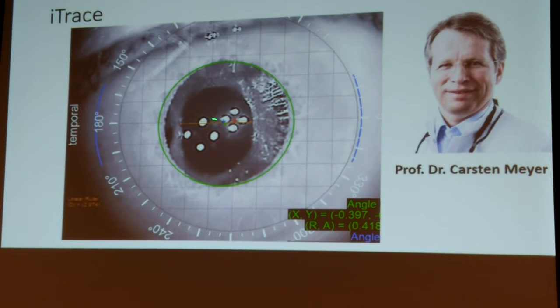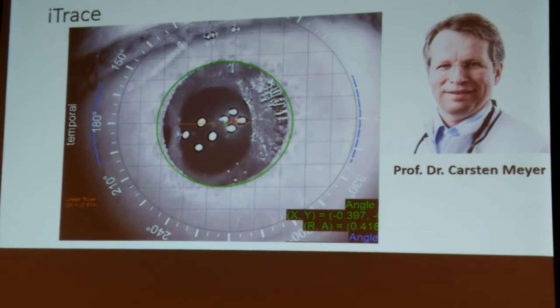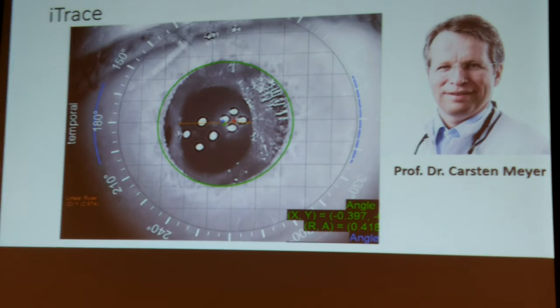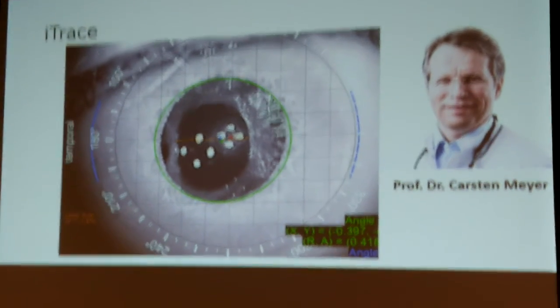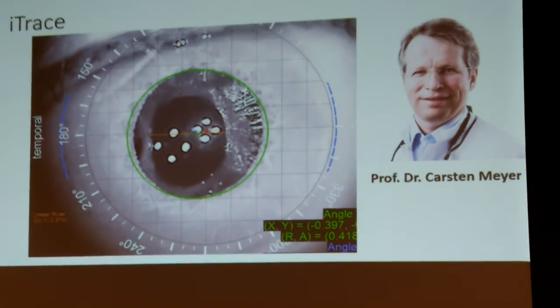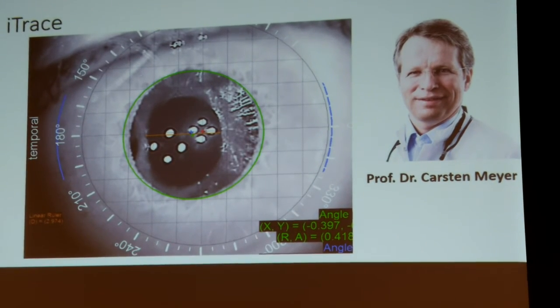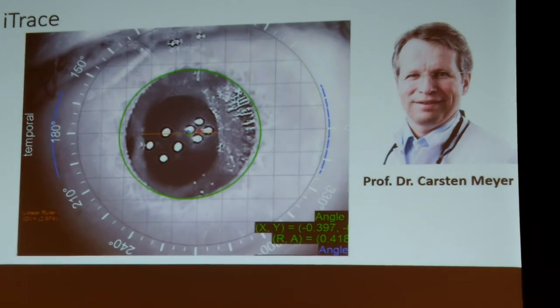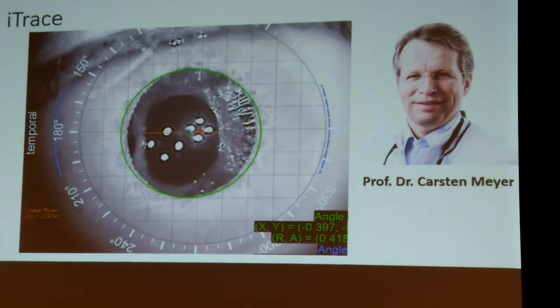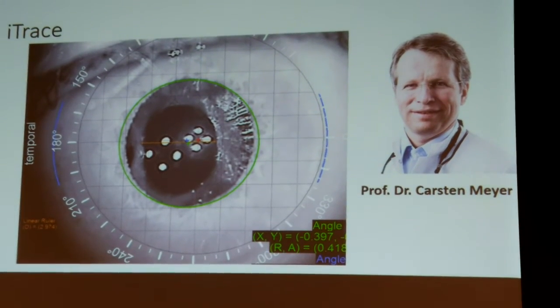That's why with an undilated pupil you can't see it, and if you go in with the slit lamp as well, you won't see anything. It's just a clear lens. Then we decided with Professor Meyer, the surgeon I work most with, what we should do, and he decided he would remove all this stuff from the anterior and the posterior surface, and then we'd have a look. And this is a 20/20 eye, so he wasn't sure, shall we or shall we not?